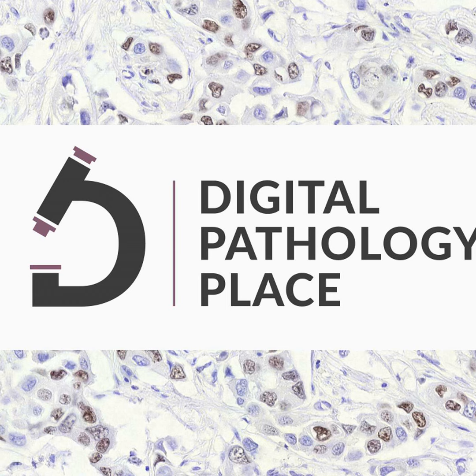Recognizing the importance of standardization in this growing field, the FDA has provided a guidance document to outline the usage of whole slide images within non-clinical pathology, particularly in the realm of toxicology. This document intends to guide industry practices and encourage compliance with GLP regulations. 2. Whole slide imaging. A. The concepts of WSI. WSI involves the digitization of glass slides to create two-dimensional digital images.